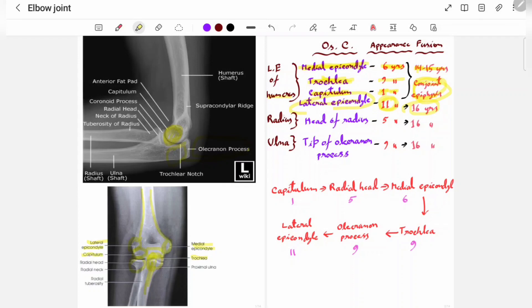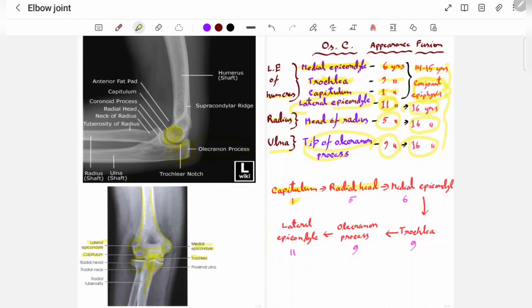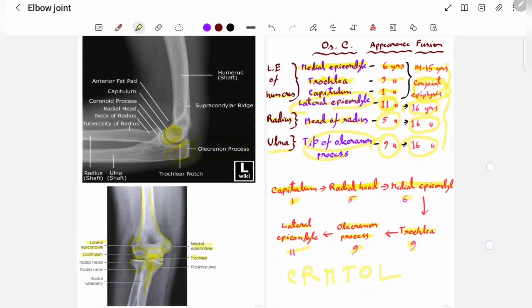The head of the radius appears at five years of age and fusion occurs at 16 years of age. The tip of the olecranon process appears at nine years of age and fusion also occurs at 16 years of age. So at 16 years of age, all structures are fused. The important sequence to remember is: capitulum at one year, radial head at five years, medial epicondyle at six years, trochlea at nine years, olecranon process at nine years, and lateral epicondyle at 11 years.